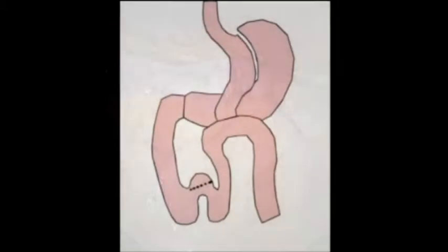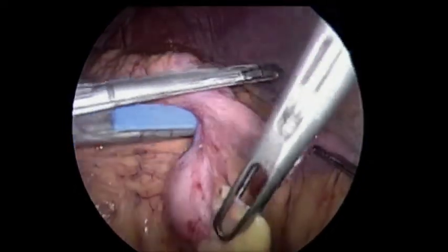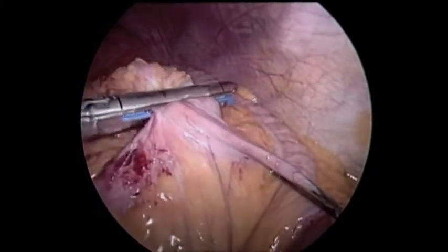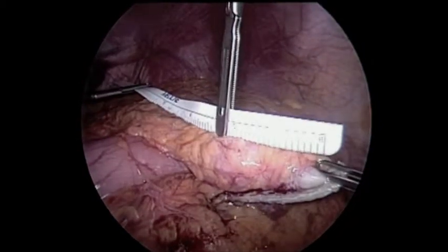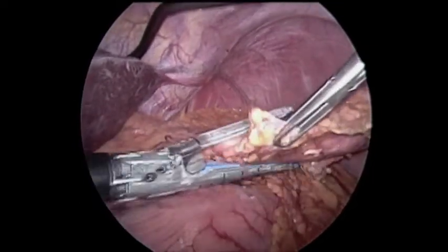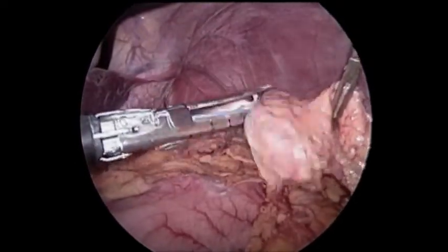Here you can see we're working our way backward. There's the pancreas. Our next step was to divide the gastroileostomy. When you do this, you want to be careful because you're stapling across an old staple line, but there didn't seem to be too much scarring, so we used a standard blue load. You want to be careful not to unduly narrow the small bowel. It was fairly straightforward to divide that anastomosis without narrowing the bowel. We felt the excessively long pouch may have been one of the reasons why he didn't lose adequate weight with the first operation.